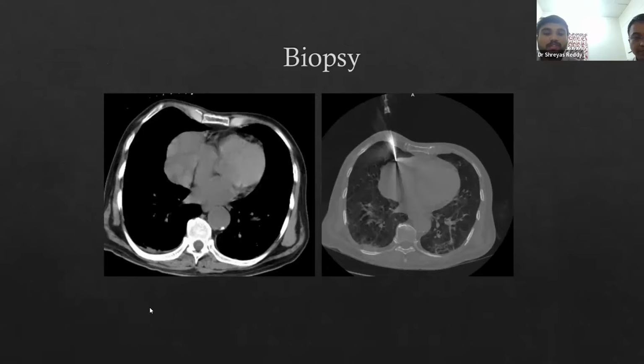So we would like to do this biopsy under CT guidance. First, we'll place the radio opaque grid and localize the appropriate entry point, following which we will sterilize the region and infiltrate the local anesthesia. So we will be using the coaxial technique to obtain multiple samples from this lesion. Yeah, this is what I wanted to get out from you. We will use a coaxial technique.